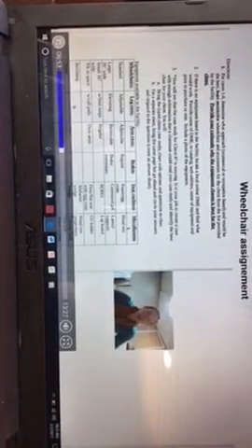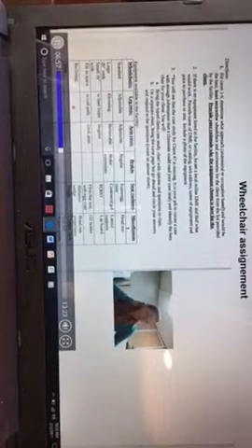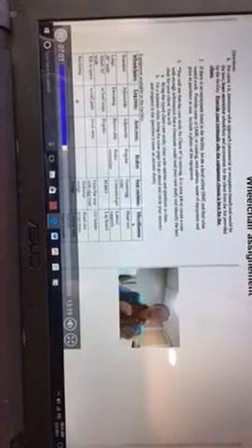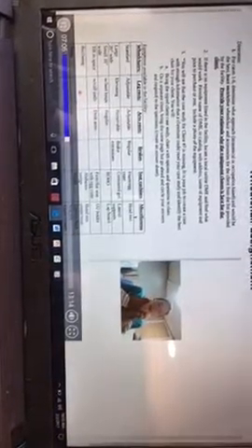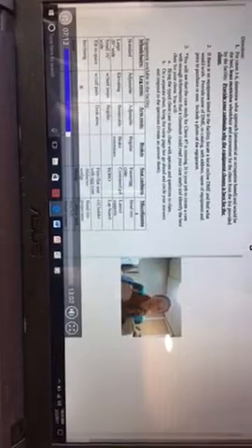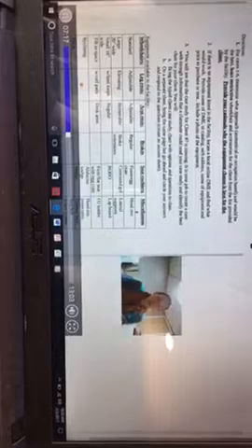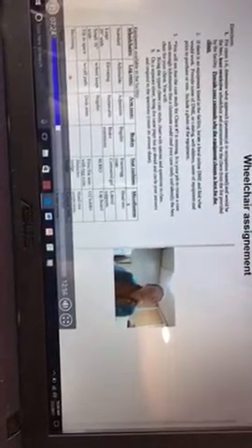A contoured gel cushion. The contoured means that it is constructed with foam on the bottom. So it starts with a more firm foam base, and then the foam base is carved out so that it has a gluteal hole in the back, and also some carved out pieces for the thighs, and then it's filled with gel. That gel will allow a person to sink down into it, and it affords a much better pressure relief.